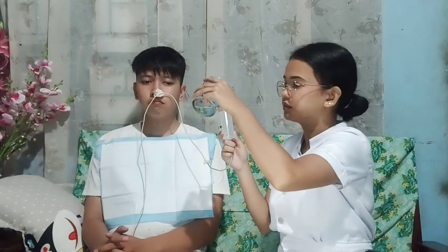And then assuming that it's finished, I will now flush it again. And then I will instruct the client, or the significant other, to make sure that the client's head is elevated for 20 to 30 minutes to prevent aspiration. And then rinse the bag and the tubing with warm water whenever the feedings are interrupted, if interrupted only.